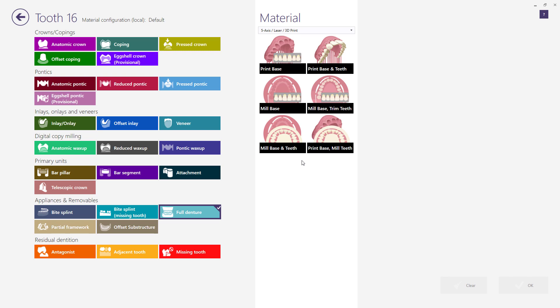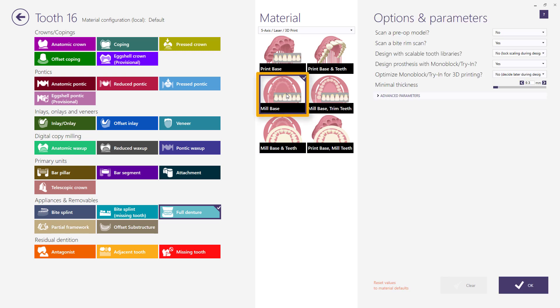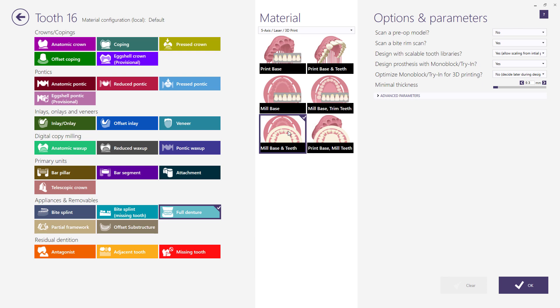For milling technology, you can choose mill base if you only want to mill the base and use denture stock teeth. Mill base and teeth if you want to mill base and teeth. And mill base trim teeth when base will be milled with tooth pockets intersecting the model and the denture stock teeth will be trimmed accordingly to fit on the base.